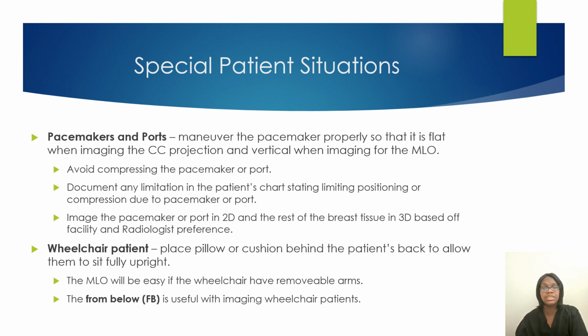For pacemaker patients, make sure that you ask the patient. Well, first, you should be checking their previous mammogram images. Make sure that they do not have a pacemaker or a port. If they do, you have to make sure that you do not compress the pacemaker or the port. Also, document in the patient's chart, patient has a pacemaker, limited positioning or limited compression.